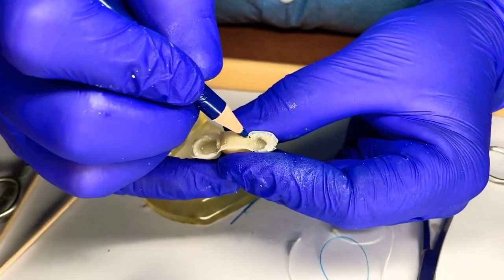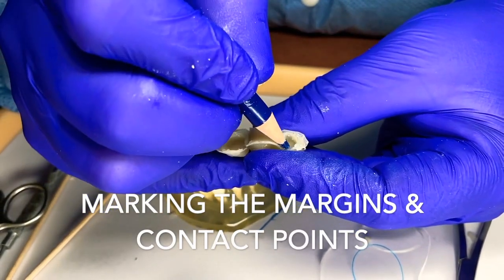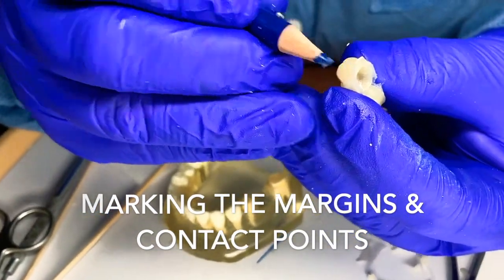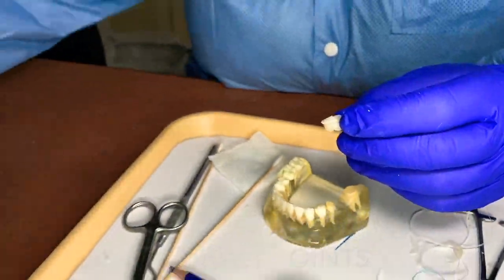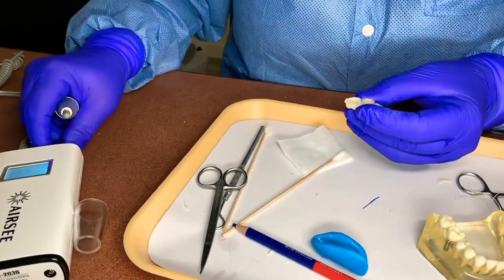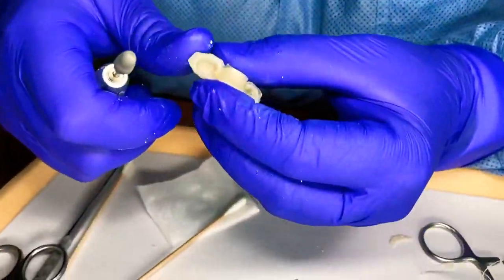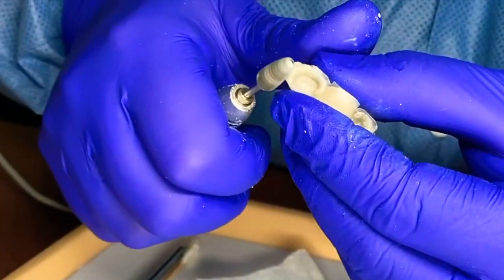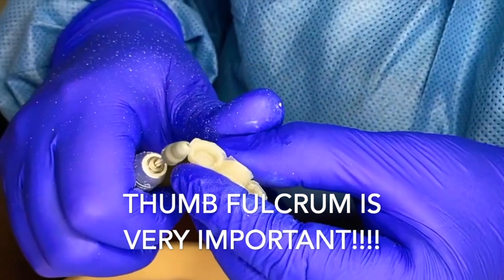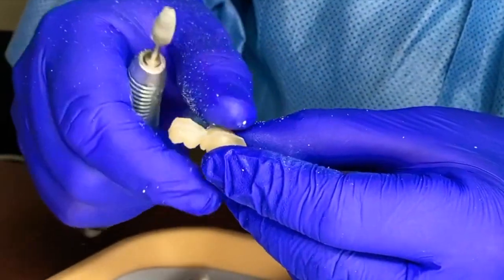Go around the edges here and there — there's our contact and our contact. We don't have a distal contact. I'm going to take our handpiece, hold it with our fulcrum, and gently bring this around.